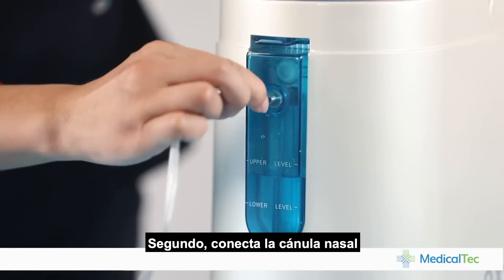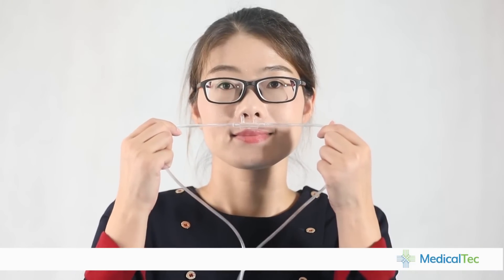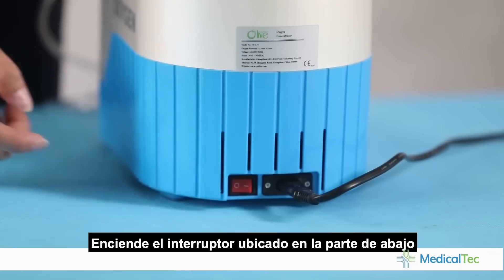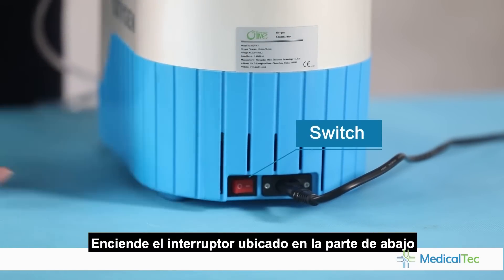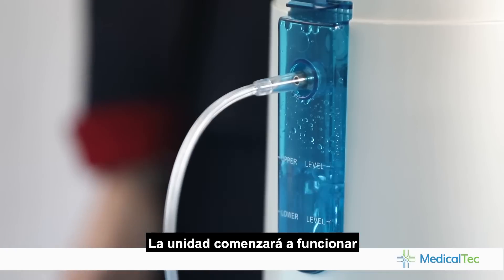Second, connect the nasal cannula to the oxygen outlet and wear it. Now begin to operate the machine. Turn on the switch on the bottom of the machine, then touch the on/off button. The unit starts to work.